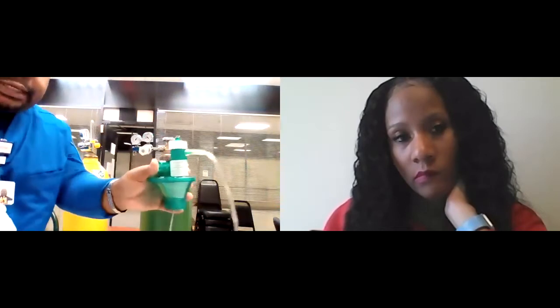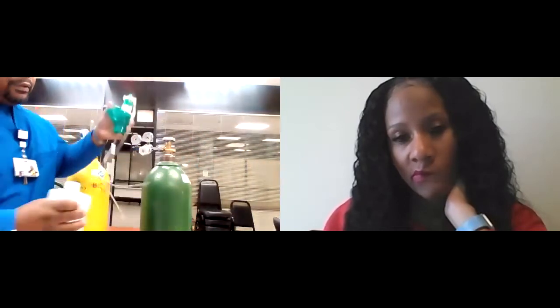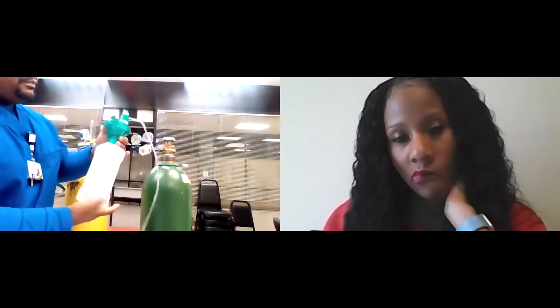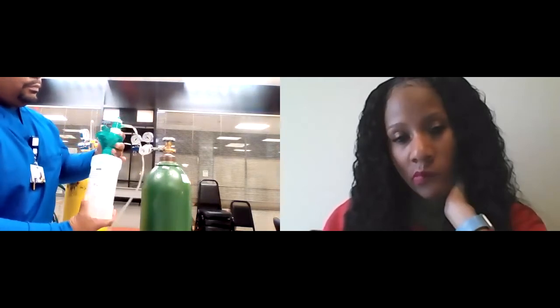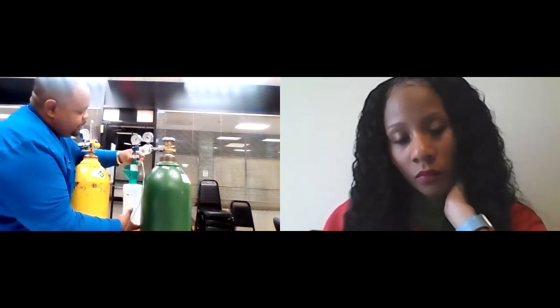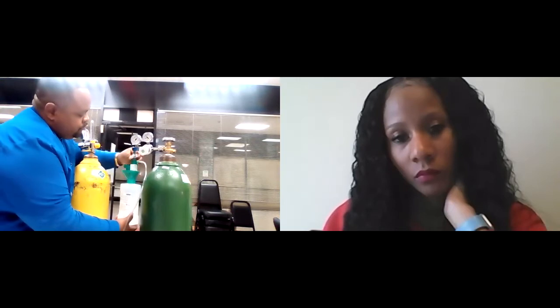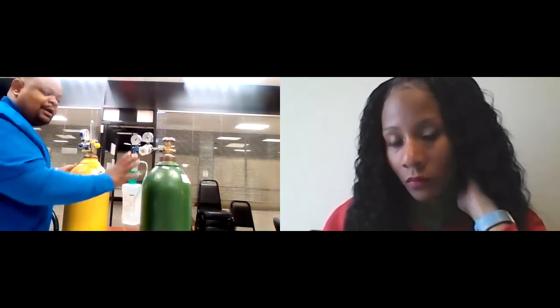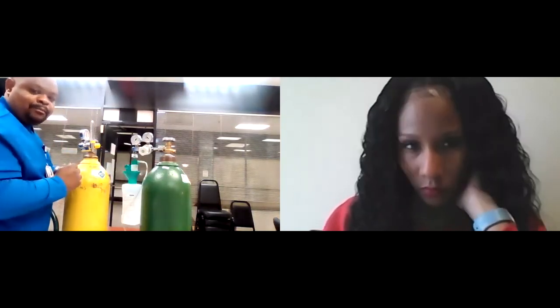This is my large volume nebulizer, which in this case is considered to be a GIN, a gas injection nebulizer, utilizing the Bernoulli principle. Okay, tighten that up. All right, and I just simply put this on here, tighten it up. All right, now, this is my first FiO2 and my first flow, because this is my first system, this will be my second system, okay?